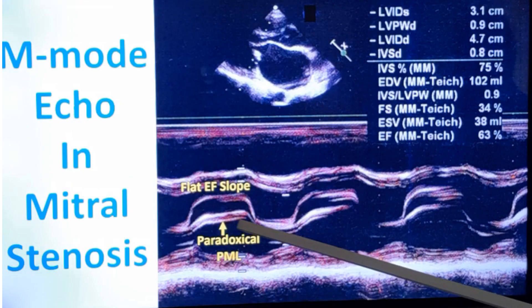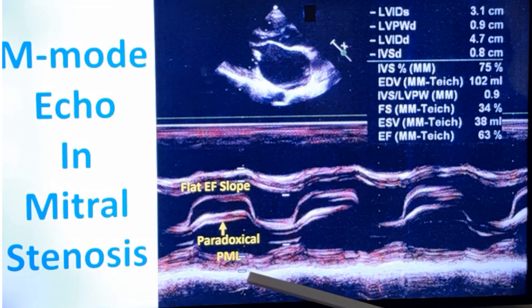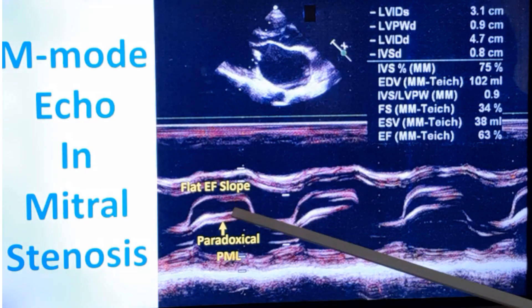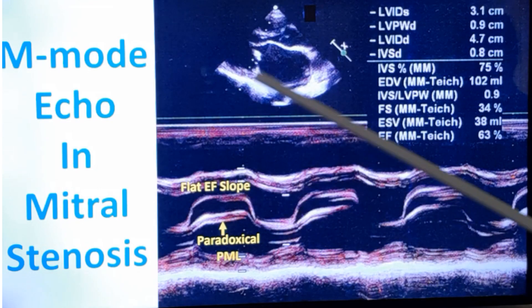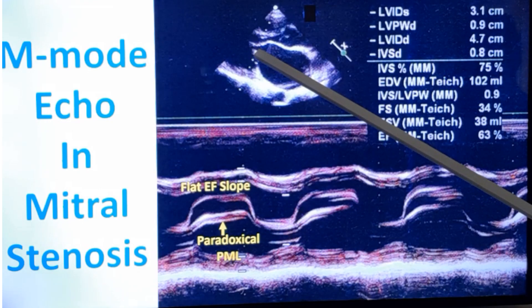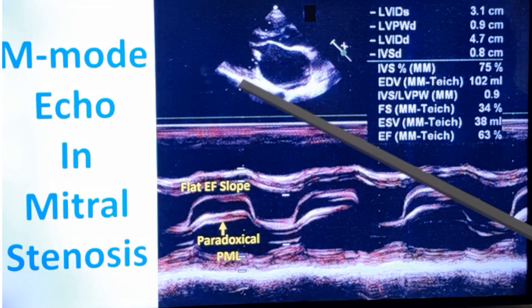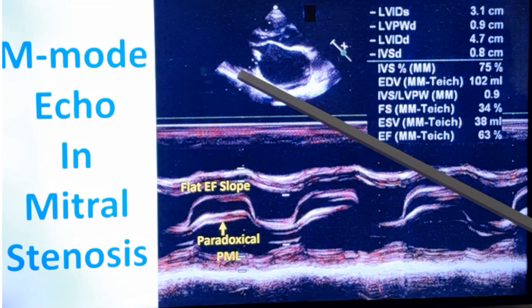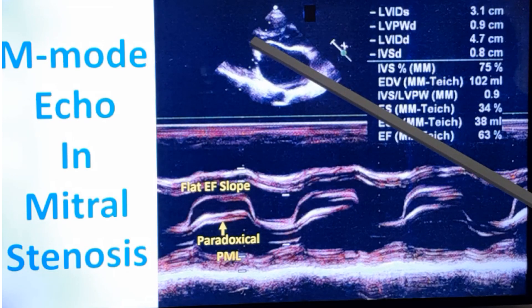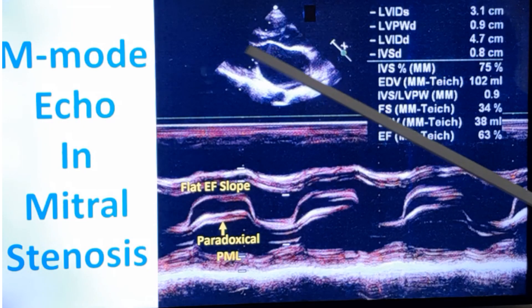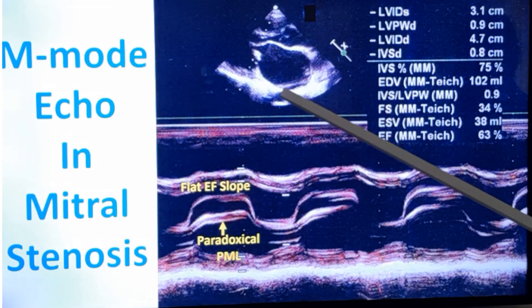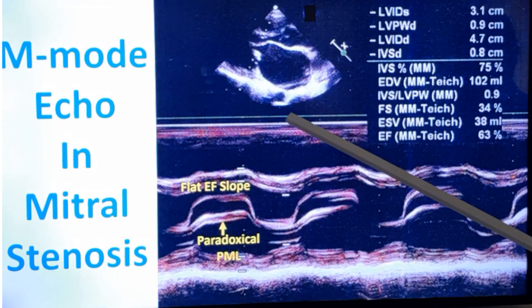You can see the paradoxical anterior motion of the posterior mitral leaflet. The separation between the leaflets is reduced due to mitral stenosis. Normally, in diastole, the posterior leaflet moves posteriorly toward the posterior left ventricular wall, and the anterior leaflet moves anteriorly near the septum, creating a very wide mitral valve opening — but this is not seen here due to mitral stenosis.